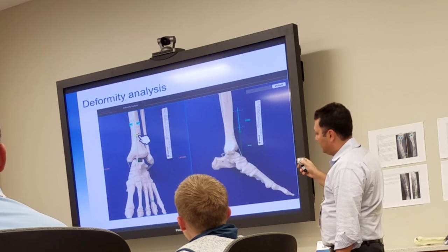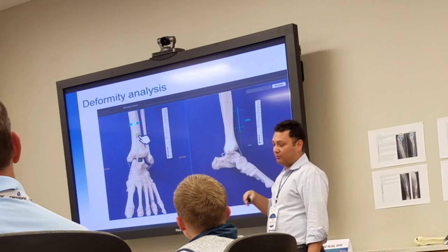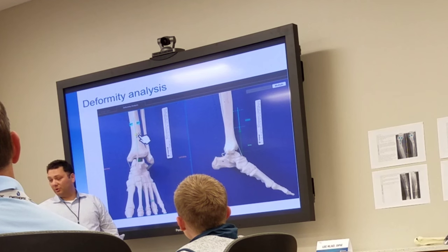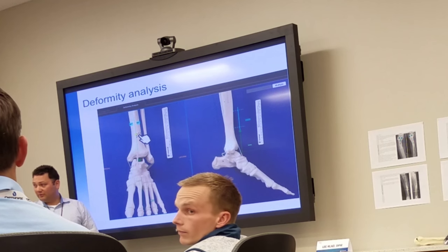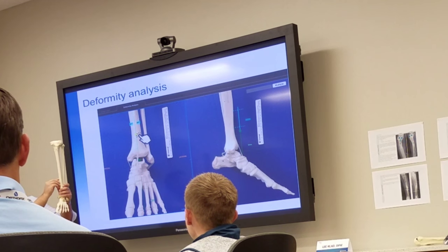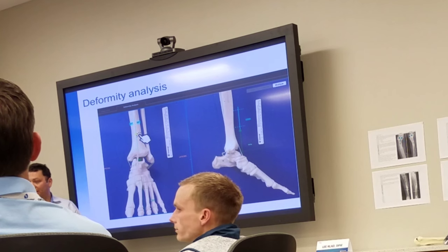In the AP, you're going to draw your anatomical axis through the tibia, and you have to make sure — this is something we need to review over and over — your lines have to be in the same spot. One of the things you can do on the bone models is take a little marker on your bone model prior to taking your picture. Mark off a spot on the side as well, so you know when you're pulling up your line in the HexRay portion, you're in the exact same spot. That would give you a more accurate reading.